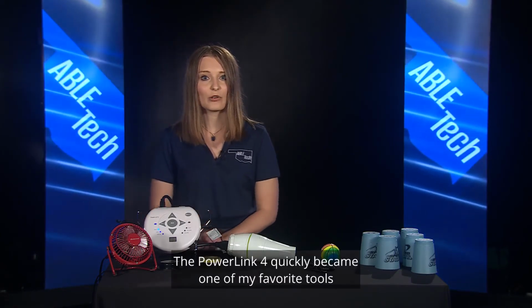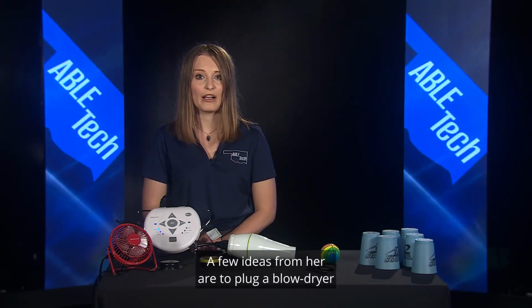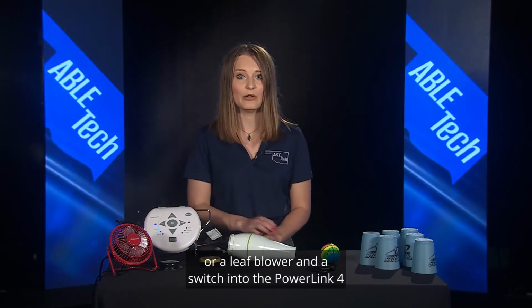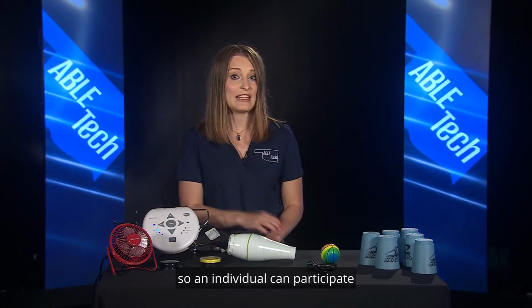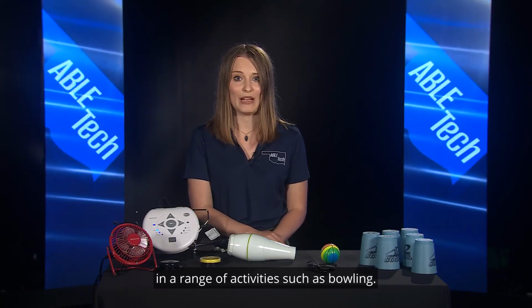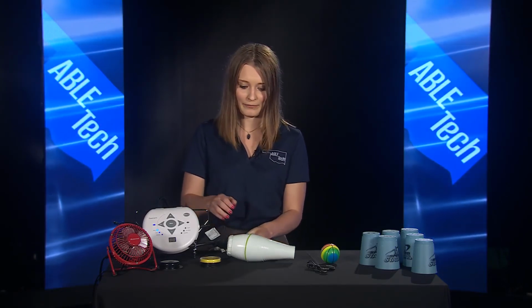The PowerLink 4 quickly became one of my favorite tools after I attended a webinar by Heidi Garrett Brislin. A few ideas from her are to plug a blow dryer or a leaf blower and a switch into the PowerLink 4, so an individual can participate in a range of activities, such as bowling. Let's try it out.